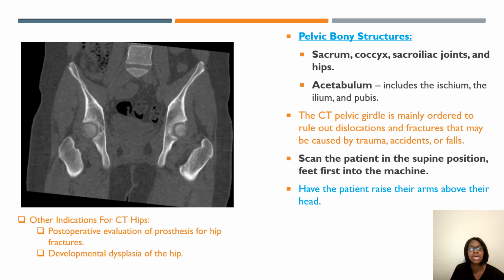Another indication for a CT hip, other than trauma, car accidents, or a fall, you may have if a patient had hip surgery. Just checking on how the hip is doing after surgery. So it's just different reasons why a CT pelvis would be ordered.